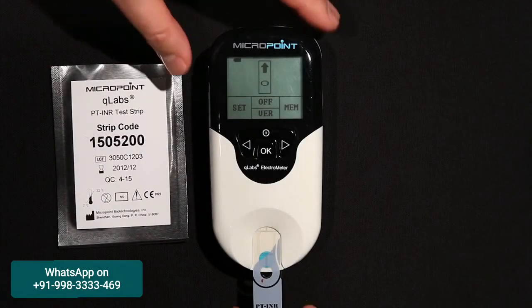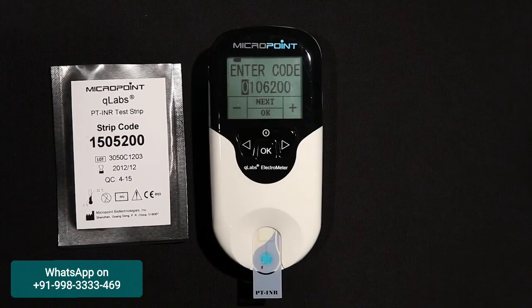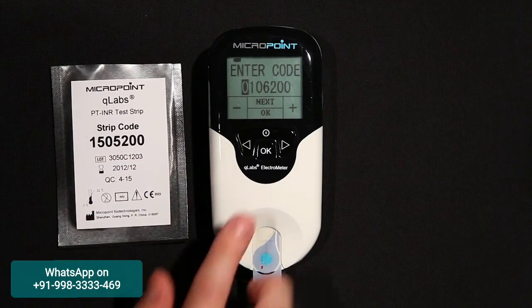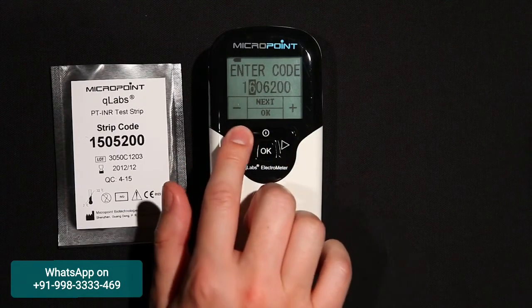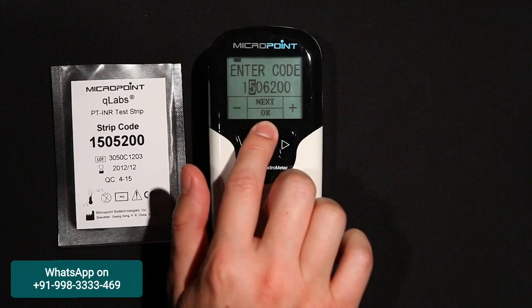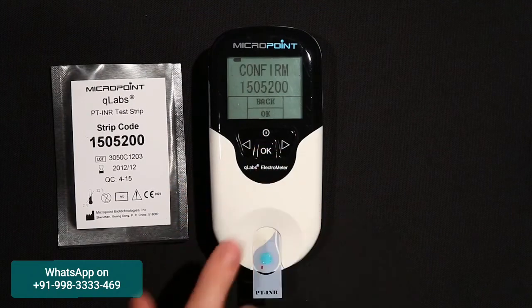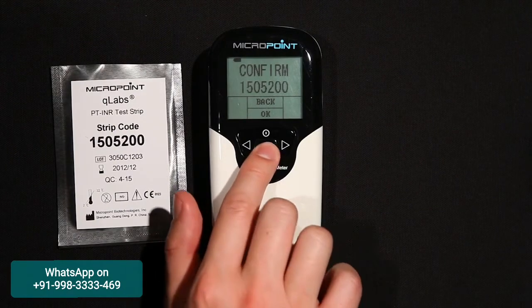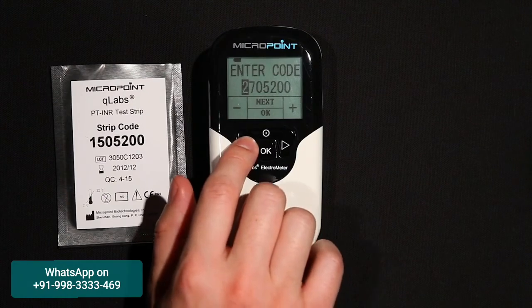When the test strip is properly inserted into the Q-Labs Electrometer, the display will prompt the user to enter a 7-digit strip code, which can be found on the pouch of the test strip. Use the plus and minus or right and left buttons to increase or decrease the value of the highlighted field. Press Next to select the next changeable field, and press OK to accept settings. The next screen will ask you to confirm the strip code entered. If correct, press OK. If not, press the back button to return to the previous screen and make the necessary changes.